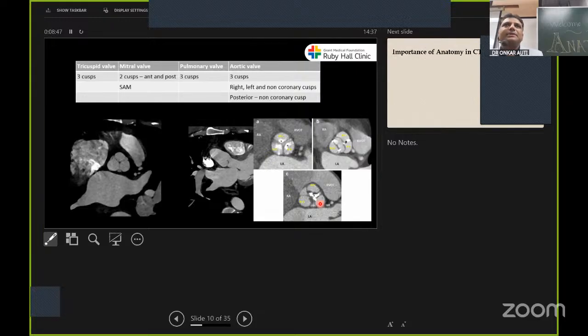Okay, so TAVR. You must have heard about the aortic valve replacement, right? It is surgical when you cut open the sternum, you cut open the aortic valve, you chuck out the old valve, and then you place the new valve over there, and then you are good to go. So that's your surgical AVR, or surgical AV replacement. Now it's an era of TAVR, which is a transcatheter aortic valve replacement. You just put a catheter through your femorals, and then you reach the heart, and you just open the valve over there, and that's done. There is no need to undergo the sternotomy and the entire surgical operation for that.